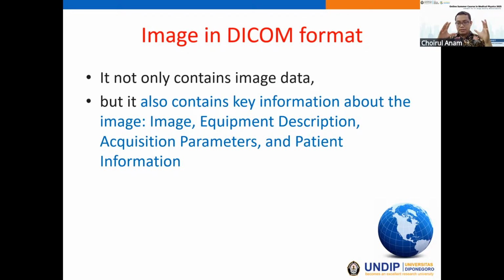So the image and the information are in one object. I think this is crucial because in communication, if the information and the image are separated, we may have the wrong information. Maybe the information from a specific patient could be used for another patient.